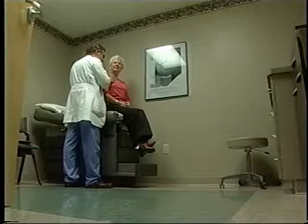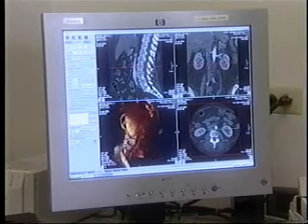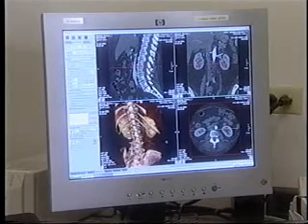Carolyn was right. On her doctor's advice, she agreed to a scan called HeartScore, which detects calcium buildup in the coronary arteries. Once 3D technology was applied, her doctor realized she needed a triple bypass. This cutting-edge tool is not only giving doctors a clearer view, it's helping to give patients a better perspective as well. Carolyn is thankful for the technology that's allowing her more time to enjoy the important things in her life.